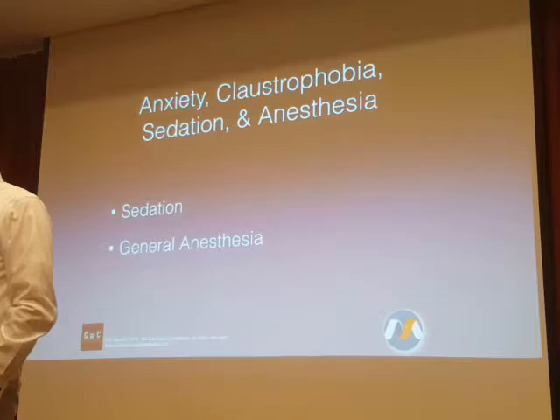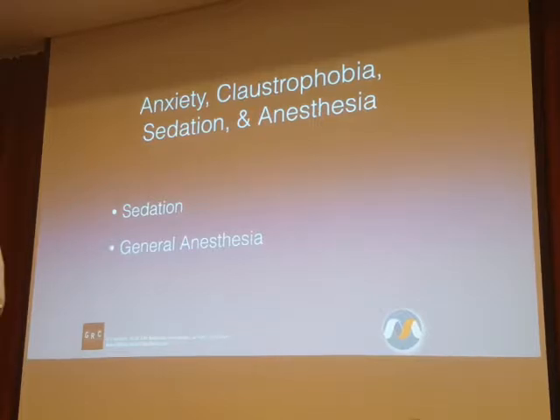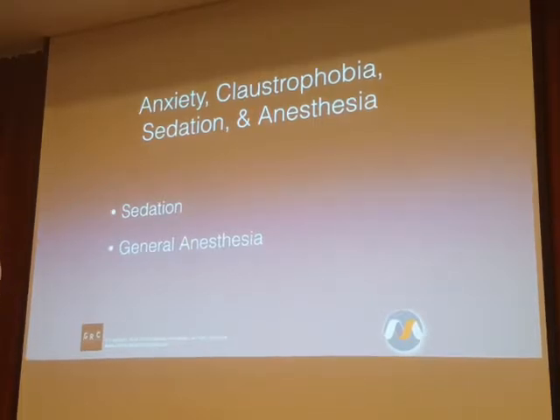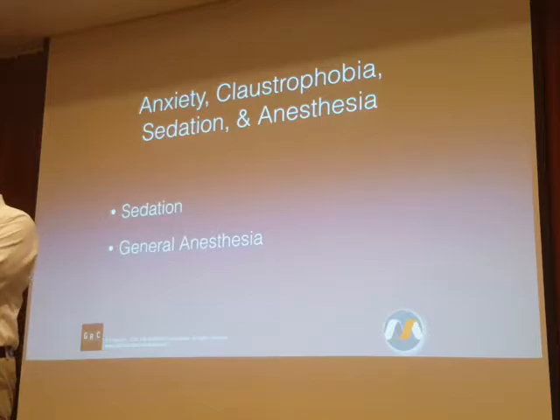Yeah, you're right that it's very dependent upon how the facility operates. KFMC, I will brag on myself a little bit because I was one of the people who actually designed the MRI suite at KFMC. And we created the anesthesia induction area, the patient preparation area, specifically to address that concern.